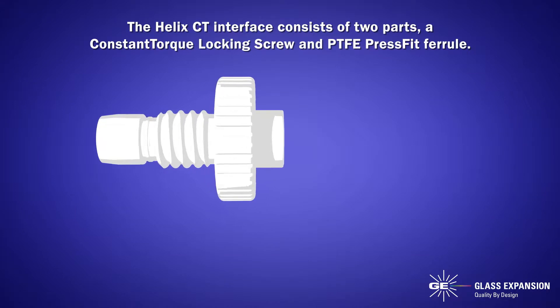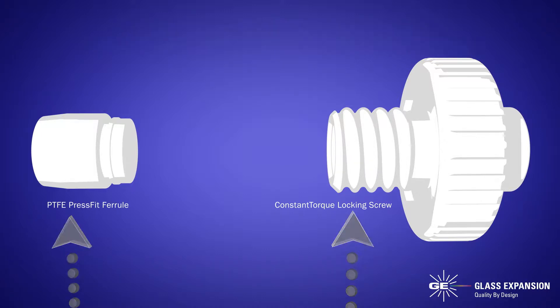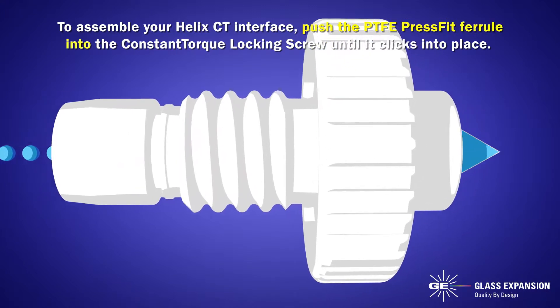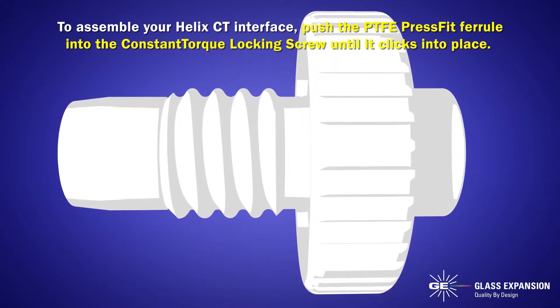The Helix CT interface consists of two parts: a constant torque locking screw and PTFE press fit ferrule. To assemble your Helix CT interface, push the PTFE press fit ferrule into the constant torque locking screw until it clicks into place.